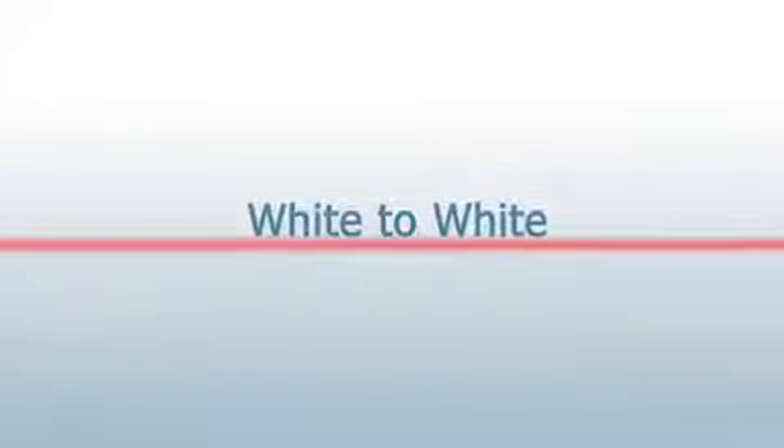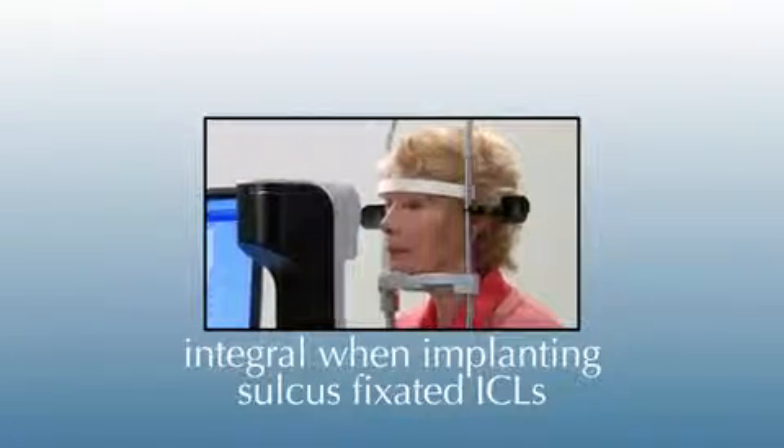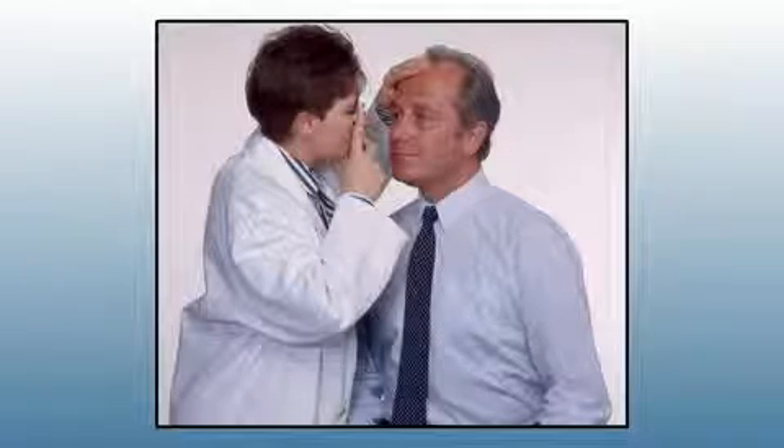This lesson will focus on white to white, a key measurement that's provided instantly with a Lenstar system. White to white data can be good to know for the surgeon implanting sulcus fixated ICLs, and it's an important data point in the Holladay IOL consultant, especially in short eyes.